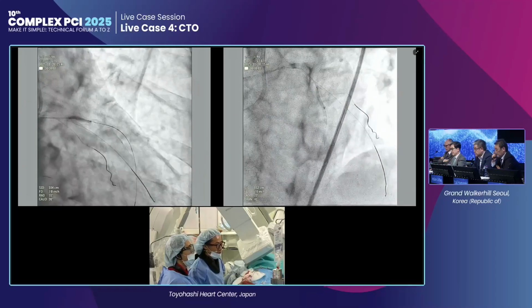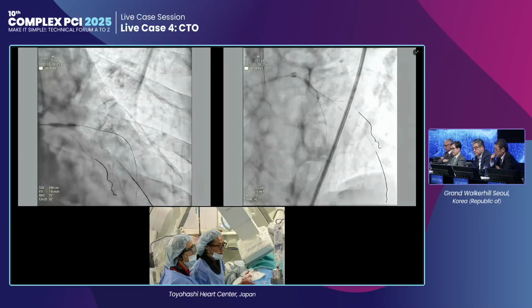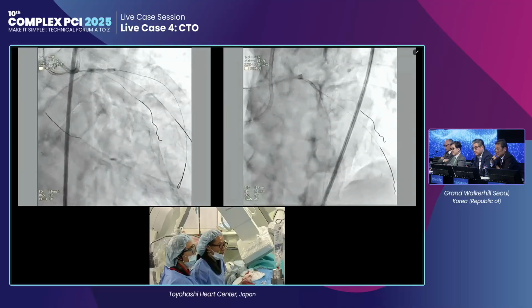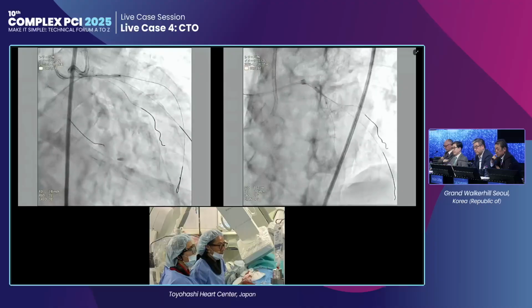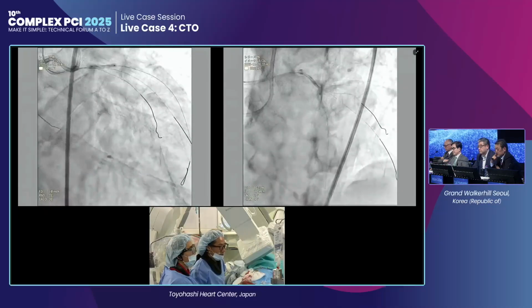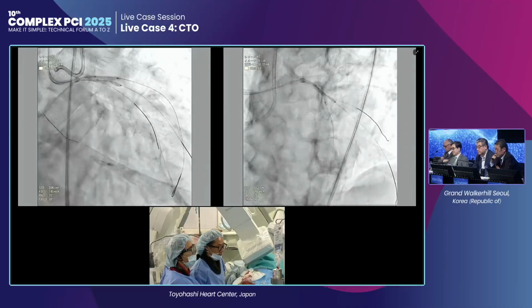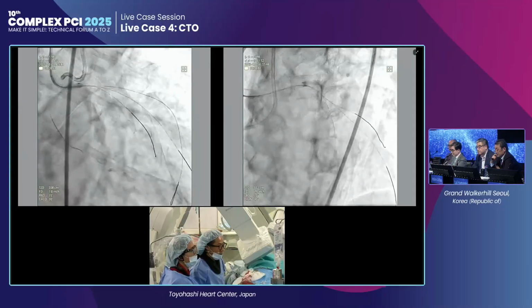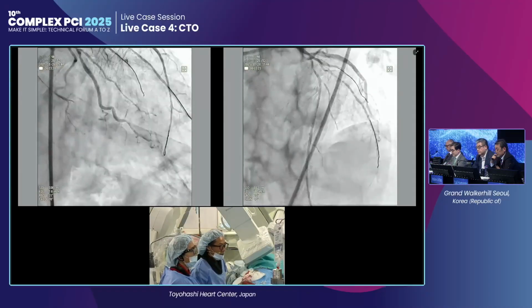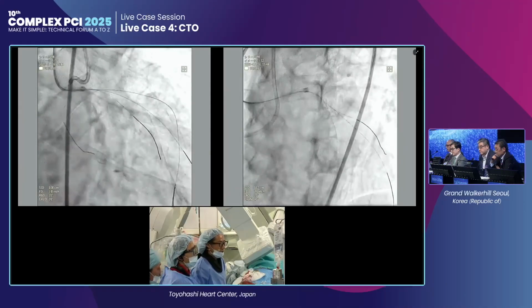Next, balloon dilatation. This is a 2.5 balloon that we use for the anchor balloon technique for the RCA. That is a very, very tight ostial region, with very calcified plaque at the site. So we dilated with KUSABI 2.25 and 2.5. The 2.5 is a non-compliant balloon. Next, this is angiography from antegrade. This is the procedure result.